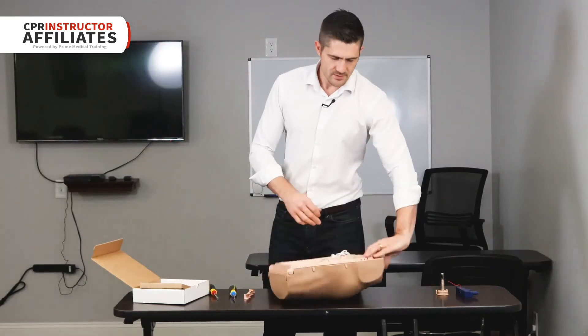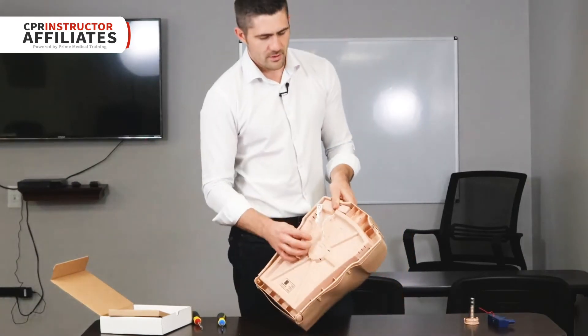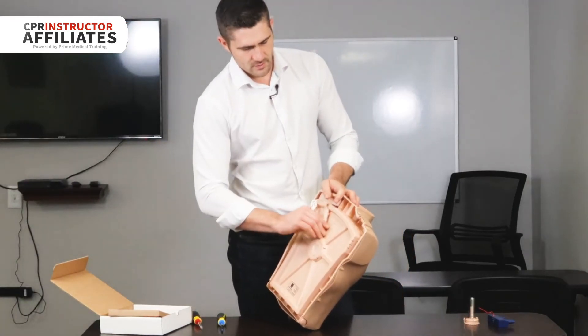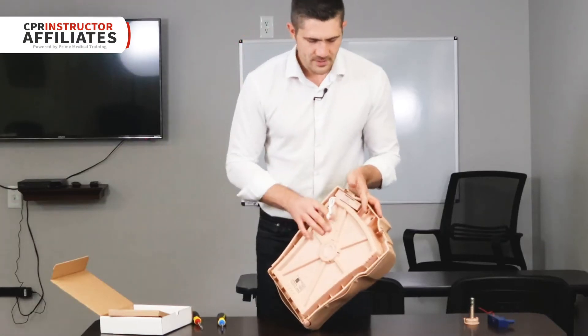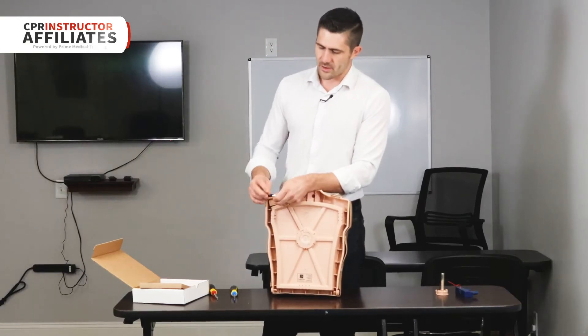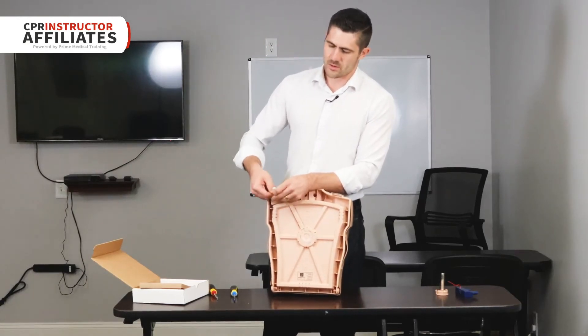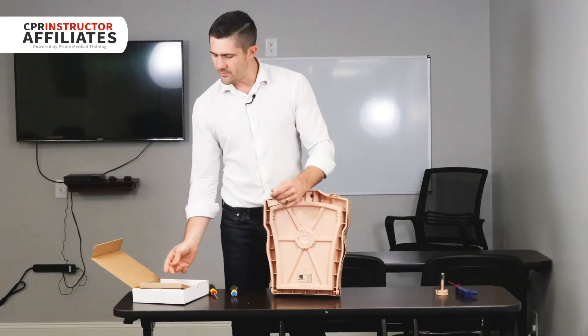Close this and set it over. You're going to take the cover — the cover goes over the cords — and just clicks into place.